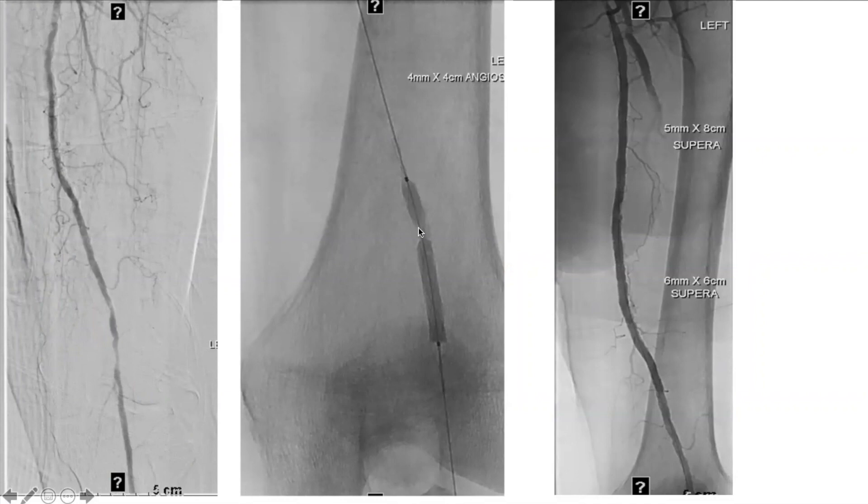The AngioSculpt has nitinol wires going around the balloon. What that does is it creates cracks in the plaque and the stenosis as it expands. Anecdotally and looking at our own internal data, we tend to have better success with lesions using this, especially if you're going to use a scaffold — whether a bare metal stent or anything else.